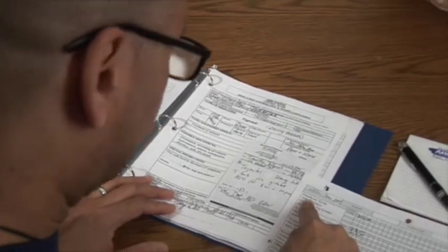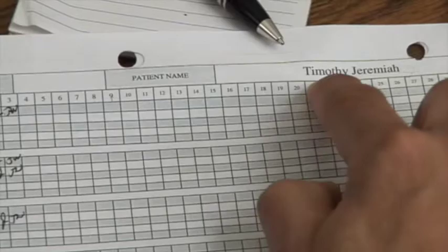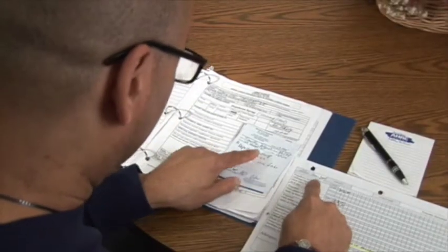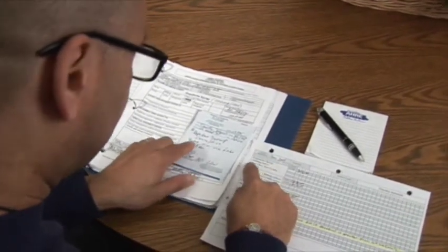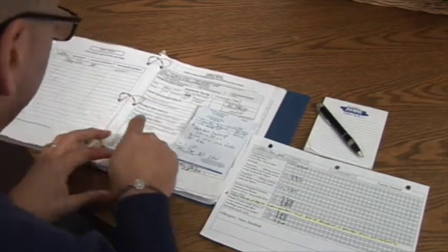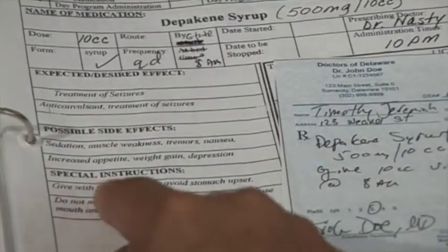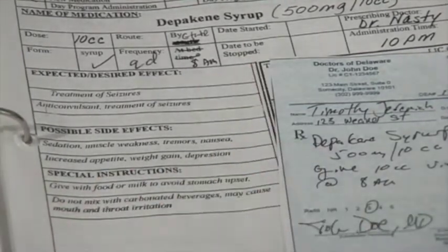I'm going to start with the Depakene Syrup. Timothy Jeremiah — Depakene Syrup — give 500 milligrams per 10 cc's, give 10 cc's via G-tube at 8 a.m., and it is 8 a.m. It is for treatment of seizures. I have to give with food to avoid stomach upset.